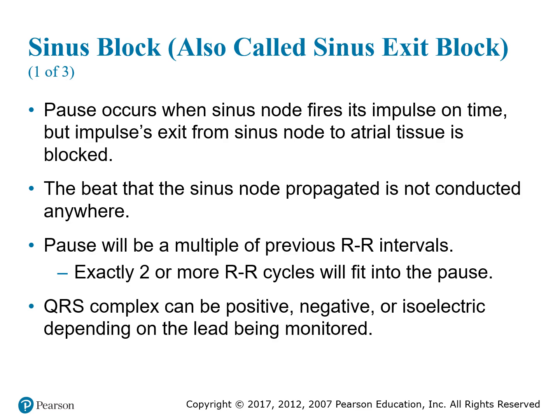The pause will be a multiple of previous R-to-R intervals. The QRS complex will be positive, negative, or isoelectric, depending on what lead you're looking at.